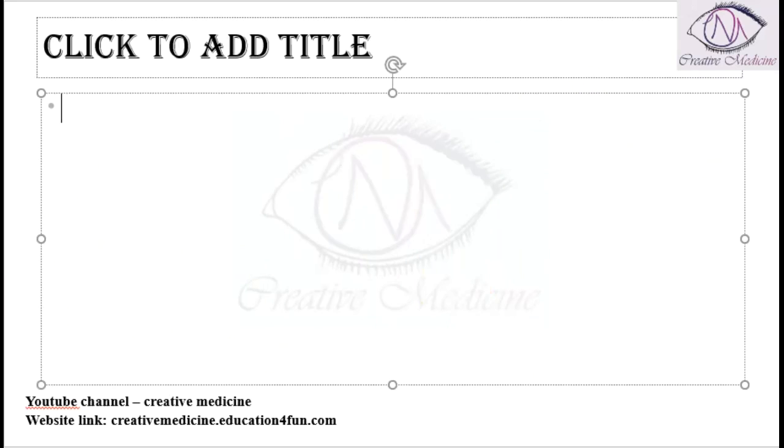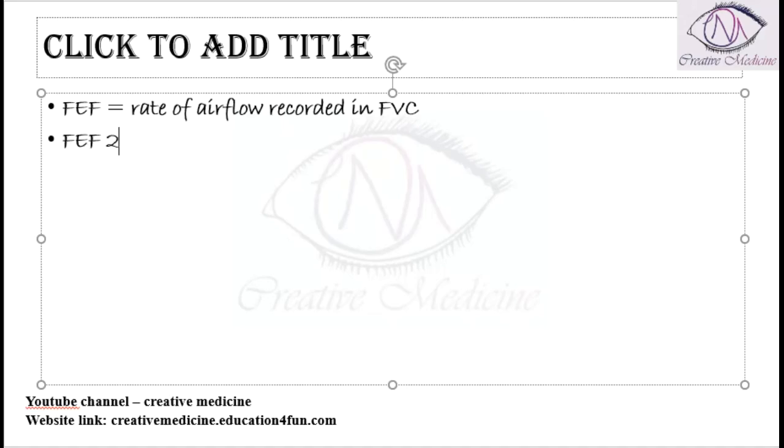Then we can also measure forced expiratory flow. Forced expiratory flow is the rate of air flow which is recorded with the forced vital capacity. While doing forced vital capacity, the maximum flow rate that is measured is forced expiratory flow. So this forced expiratory flow can be measured for 25 to 75%. And this forced expiratory flow between 25 to 75% is the average flow rate which is seen in the middle 50% of the forced vital capacity.